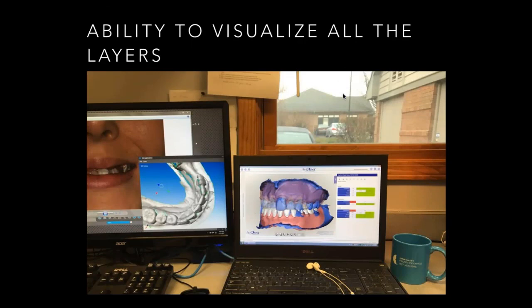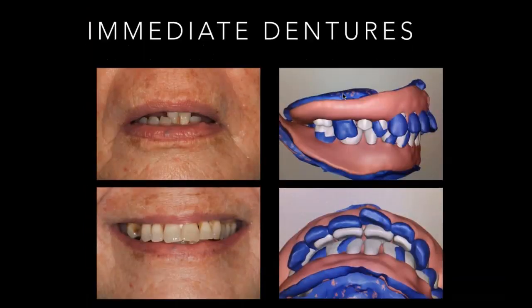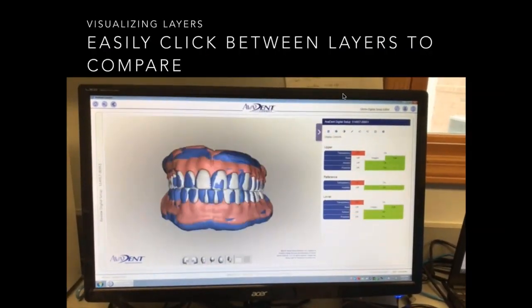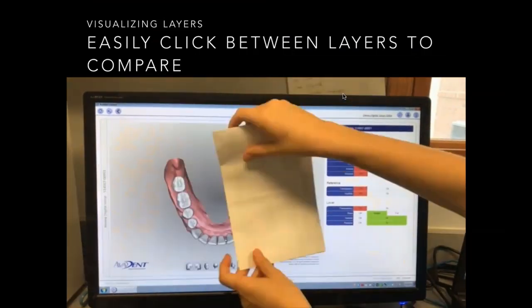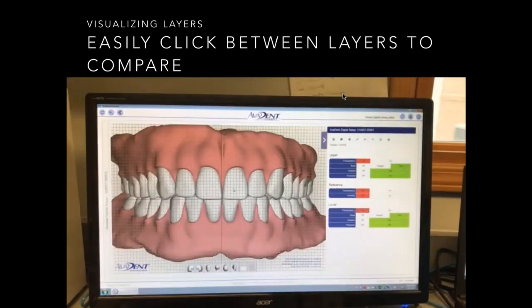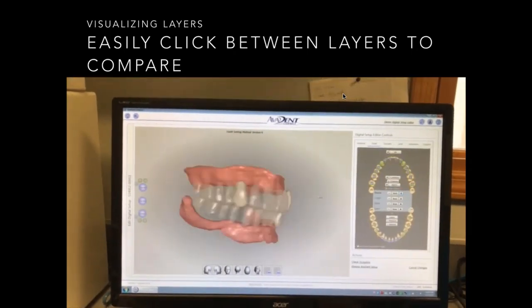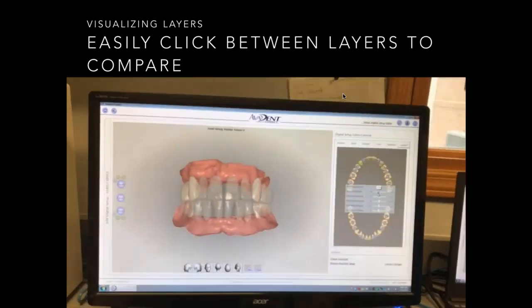But moving on, one of the amazing advantages of digital is that when you're setting teeth, you have the ability to click back and forth between the current tooth position and the new tooth position. So here, when you have an immediate denture, you can see the exact proposed changes we want, as well as the position of the patient's current teeth. So with the scans of the patient's current teeth and photographs, we're able to do a lot of really neat things with moving the teeth and constantly referencing all of these great anatomical references, where their teeth are, where we'd like their new teeth to be. And having all of those references is, to me, the most wonderful part of it.